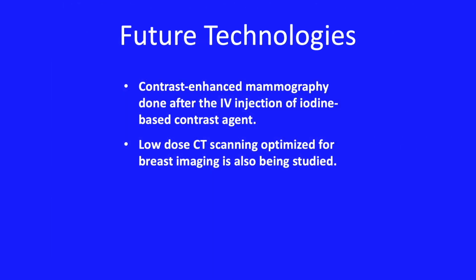Another new technique being studied is contrast-enhanced mammography done after the IV injection of iodine-based contrast agent. Low-dose CT scanning optimized for breast imaging is also being studied.